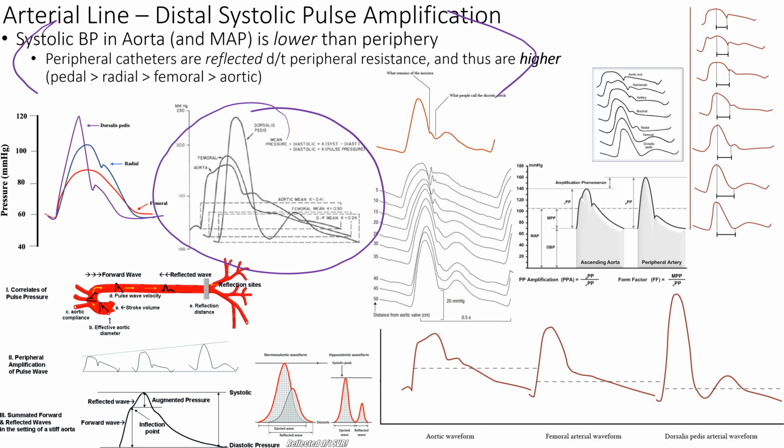And the other piece is that your systole and diastole and your map, yes, will be accurate every time depending on whether it's dampened or underdampened. But now what we're talking about is, if I have a radial artery, is that the same as the pressure in my chest? And the answer is no, it's different, right? Because we actually are reflecting the impulses from the chest. So here's my heart right here, pumping blood, right? Here I've got a little A-line waveform. It's going to be reflected and refracted and echoed and get louder as it gets to the periphery.